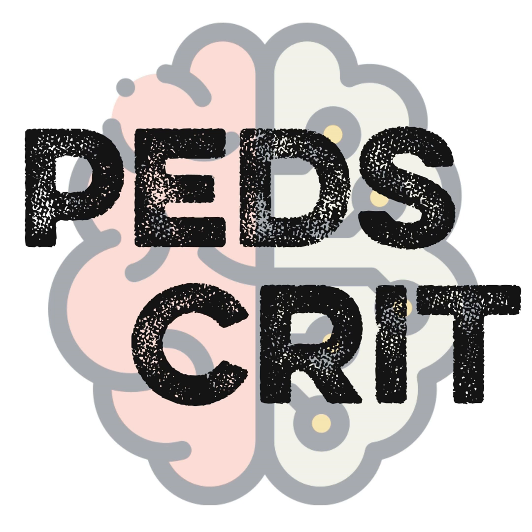So I think the primary thing I'm thinking about when I think that we are on max APRV support is, what is that P high? Once you start getting into the 30s, I do get concerned about the risk of barotrauma, similar to how one might think of a max setting on the oscillator, mean airway pressure in the 30s, probably. That would probably be my limit, mid 30s of the P high.